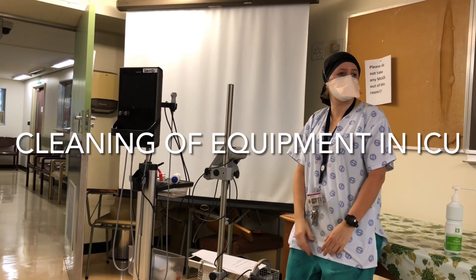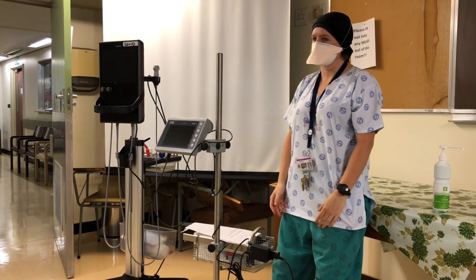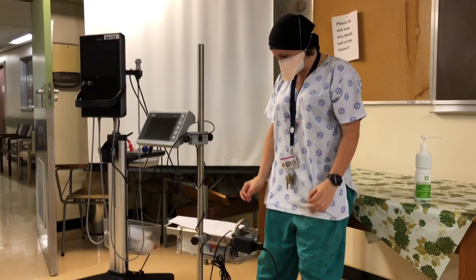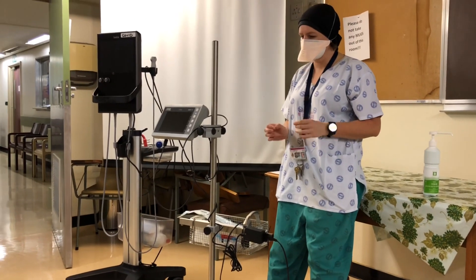My name is Mania, I'm one of the clinical technologists in the hospital. Today I'm just going to talk to you about the cleaning and maintaining of the airway, the difficult airway cost, and the ultrasound. A lot of the time these things aren't cleaned properly and not properly maintained.